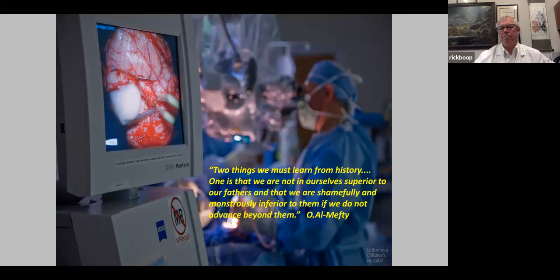With our intraoperative MRI, I'll also add that an intraoperative DTI is a 3-minute sequence, and we can see exactly where the tracts are on DTI and can actually measure how many millimeters of tumor we have before we get to corticospinal tracts, and we can update our frameless stereotaxy so that we account for shift using intraoperative MRI. For me, that's been the most useful thing.